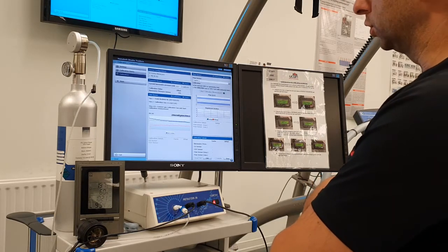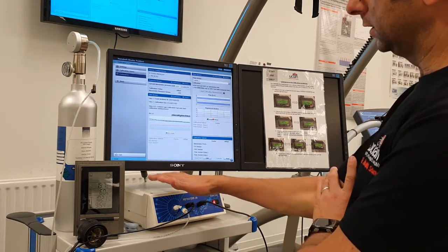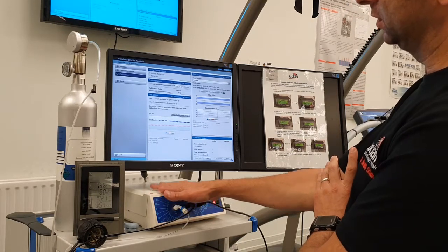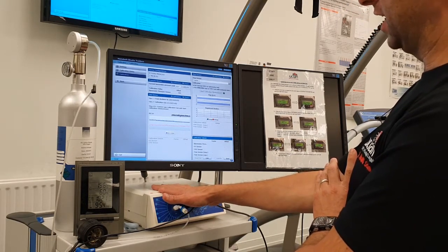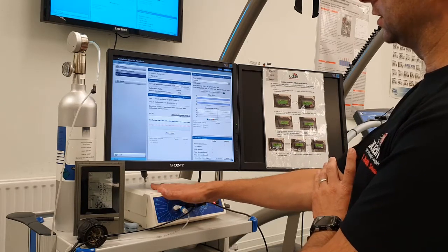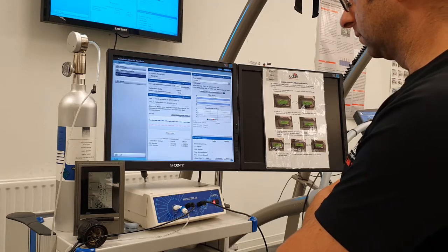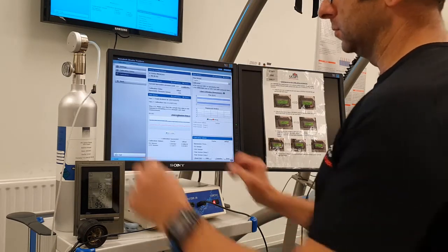One point to note when doing this calibration: you need to turn the Metalyzer on about 45 minutes to an hour before you do any calibration or testing, because you need the sensors to warm up first. Okay, so that's that bit done — you can take that out.